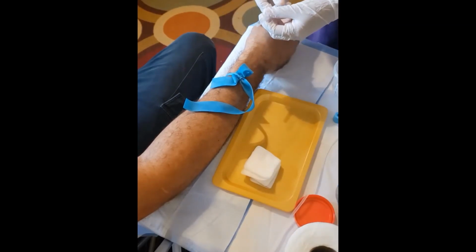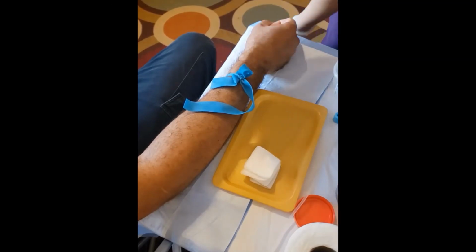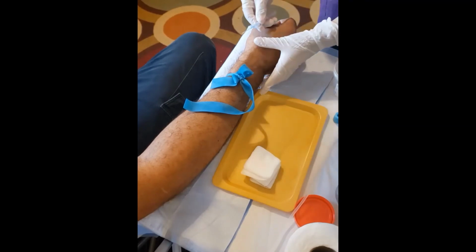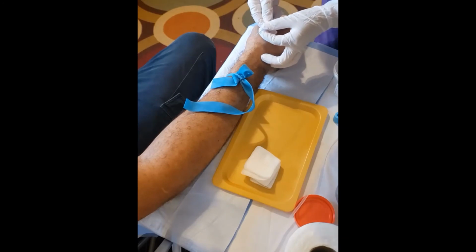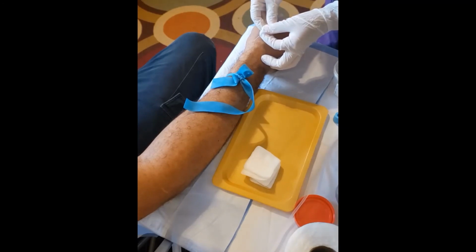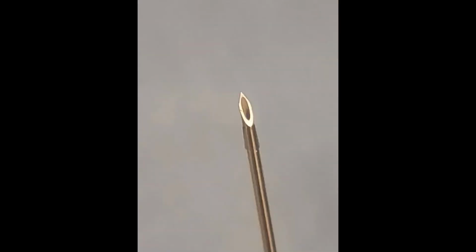At this point, you can make an assessment of the right size cannula for your patient. Be aware of the needs for that site and choose accordingly. Patients receiving blood and blood products need to have a larger bore intracath than those receiving fluids and medication only. Clean a site using aseptic techniques from clean to dirty using a circular motion or single strokes before the puncture occurs. Ensure that the fluid is dry before you puncture.